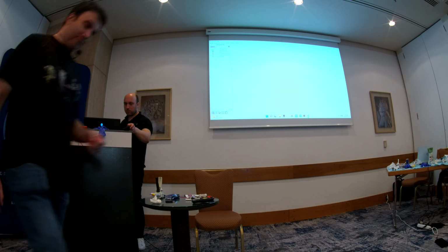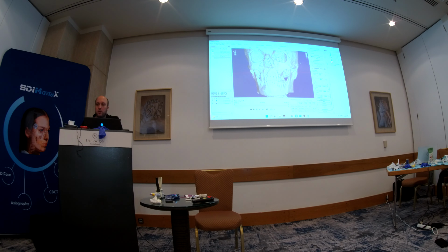This is what works right now in automatic mode, but we will do it in manual mode so you understand which points are required to place and why we need them. The first item is called basic cephalometrics. Basic cephalometrics comprises only 7 points. That's what you will do tomorrow. Today we'll just discuss how to do that.